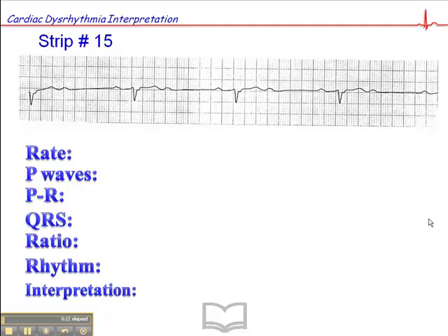Just at a glance we can see that we have a pretty bradycardic rhythm, and so the question now is what is this rhythm. When you look at a rhythm like this, your differential diagnosis could be third degree AV block, second degree AV block type 2, but let's get into the detail here.